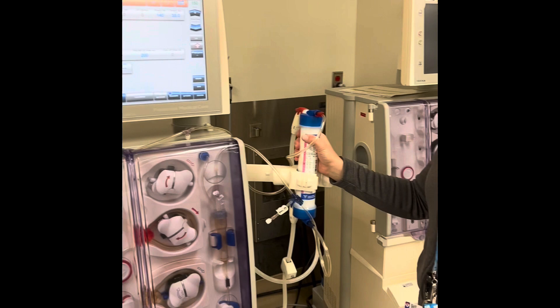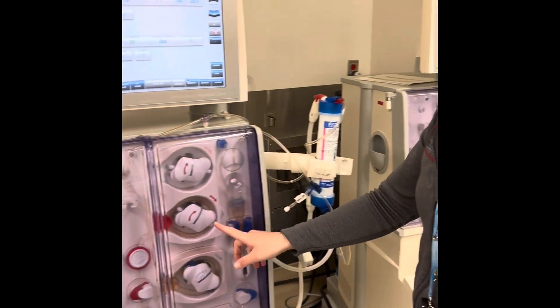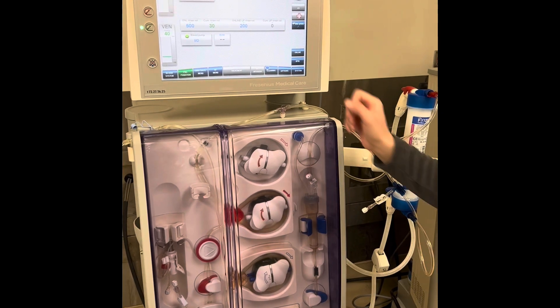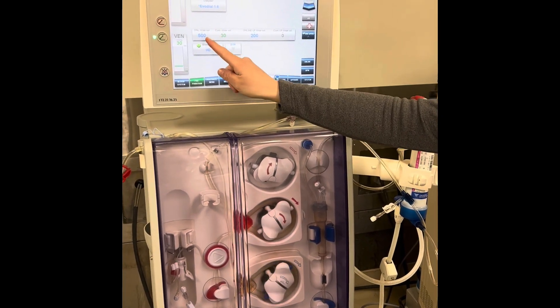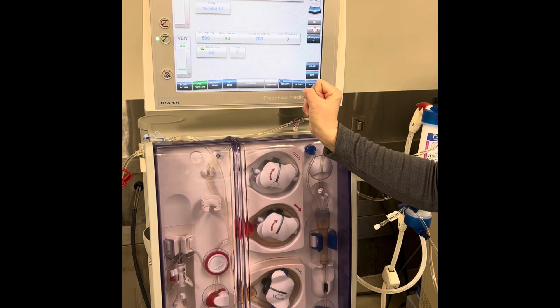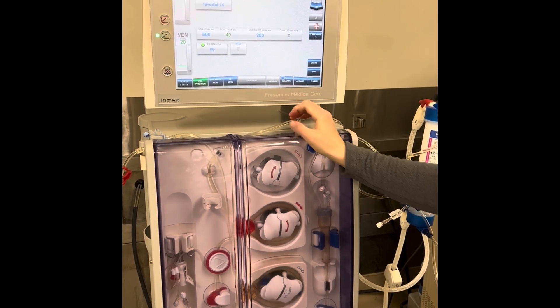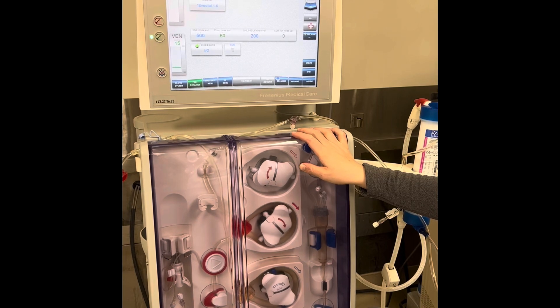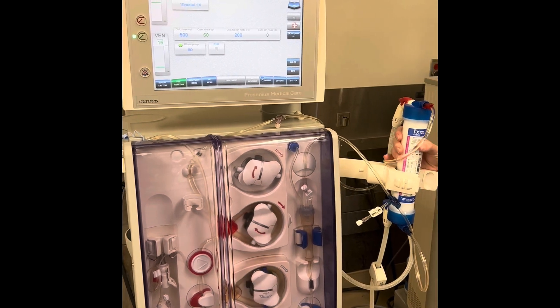The dialyzer is now primed, and it's rinsing and priming your blood circuit. If you see here, you have your online rinse volume and your accumulated rinse volume. Once it has completed the total rinse, you are going to be ready to go and connect your patient.